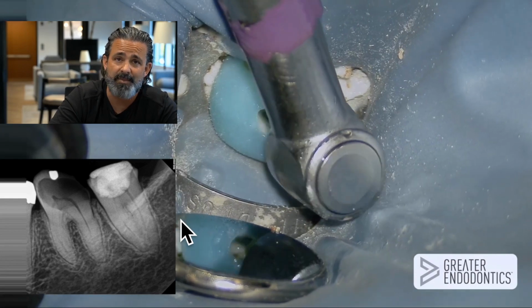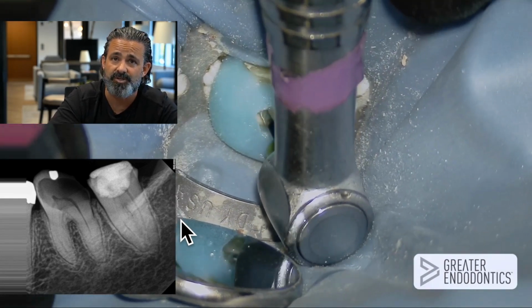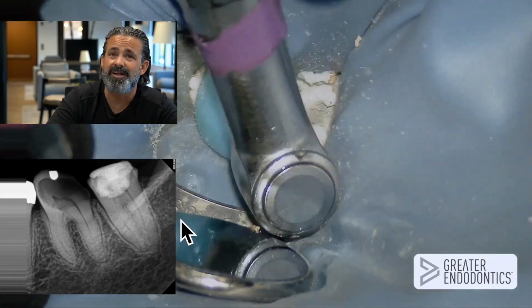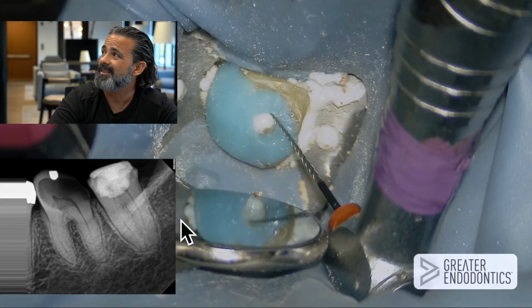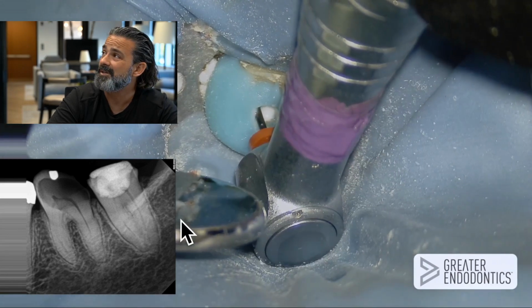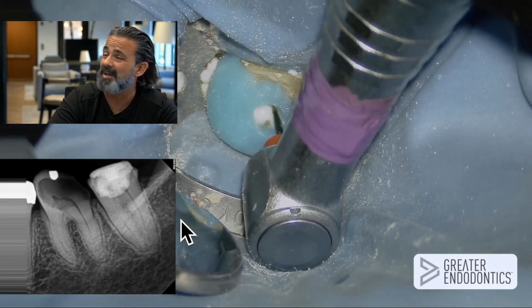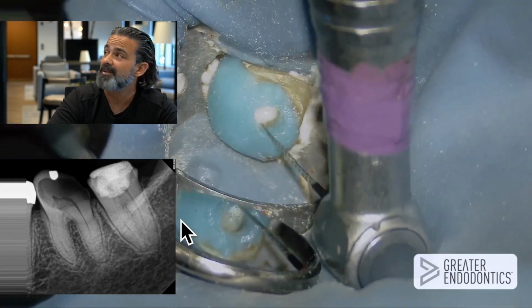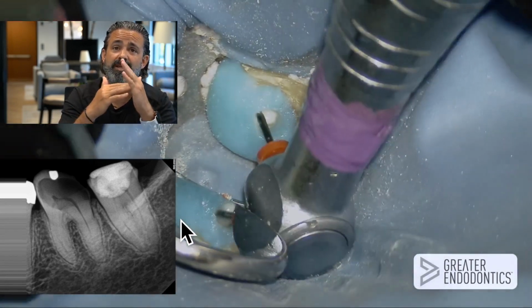And I play this little game in my head of guessing how right I really was to that original pre-measurement length. And I'm actually having a little bit of an issue now. As I'm going in, this 1506 didn't want to go very far. I went kind of mid-route, and I switched to a 1504 to see if it would go down to my kind of corrected working length. And it kind of didn't do it. It was really hard, and I could feel that file hitting just boom, hitting that brick wall.